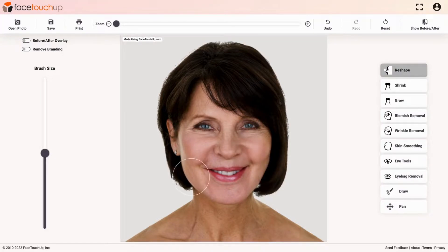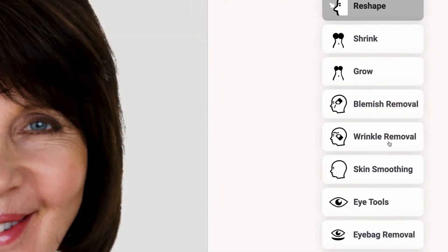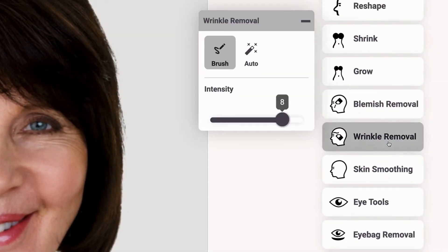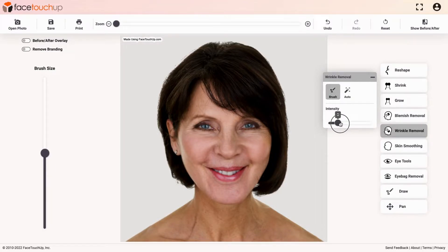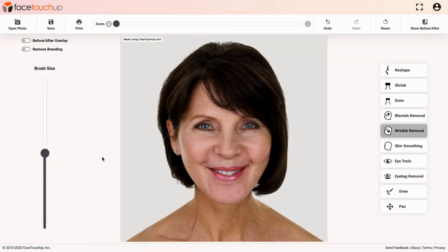You can also remove any unwanted wrinkles by selecting the Wrinkle Removal Tool. You can either use a brush or use the Auto feature. The Auto feature will automatically detect and remove any facial wrinkles. Select Brush to make changes manually. The intensity of the tool can be adjusted from the scroll bar. Adjust the intensity according to your needs.